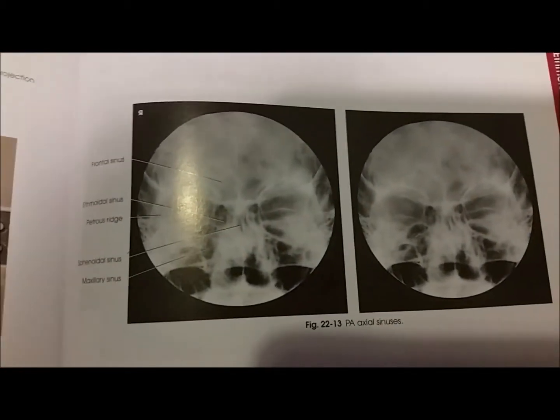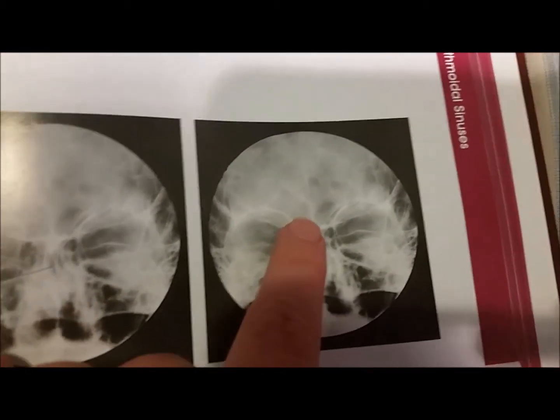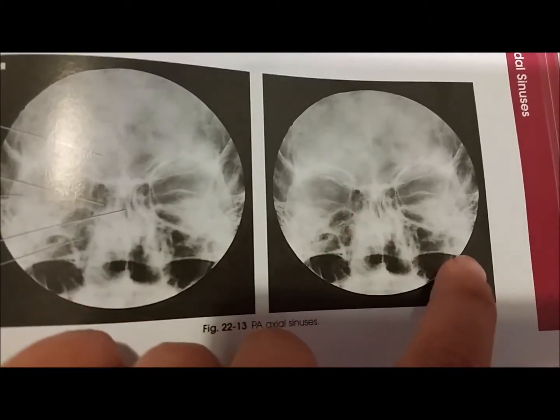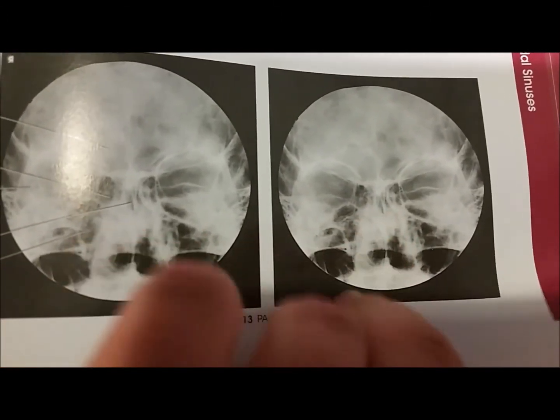Next we have our PA axial Caldwell view right here, looking at the image. We're looking primarily at the frontal sinuses right there, but you can also make out the ethmoid and the maxillary. The sphenoid is somewhat visible in the center right there, but is pretty hard to see.